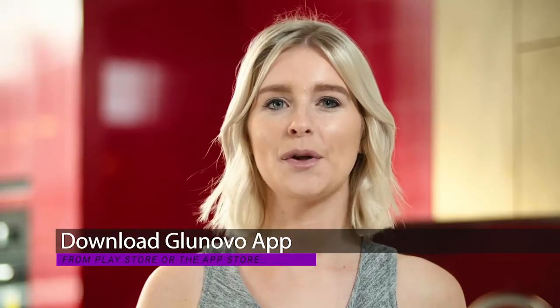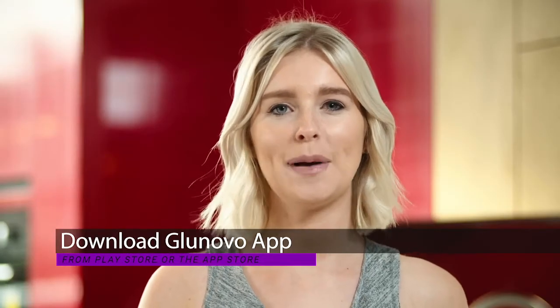I will now show you how simple the GluNovo app is to use and how to apply the i3 sensor. I will get you started using the GluNovo i3 CGM system in no time. Download the GluNovo app from the App Store or the Google Play Store. Once downloaded and installed, launch the GluNovo app.